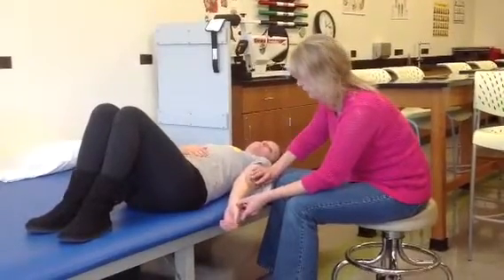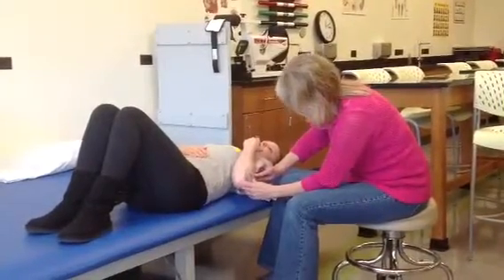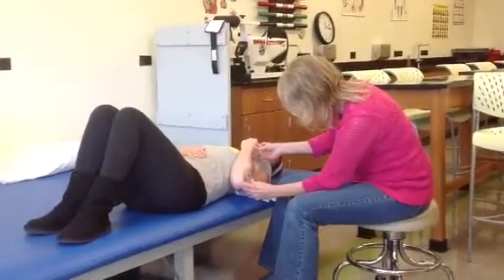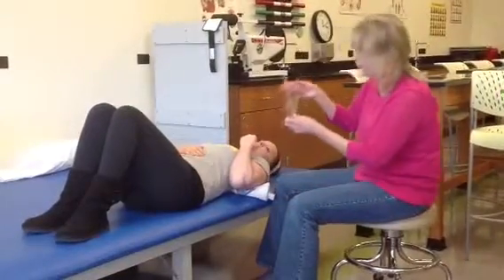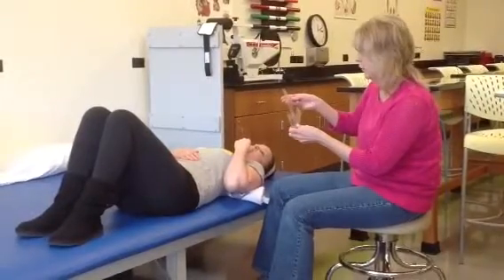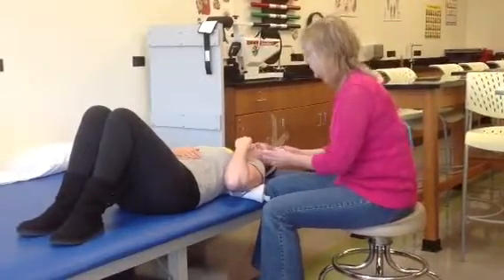Then we're going to ask the patient to raise her arm all the way up to get her flexion measurement. Again, we're going to have the axis right here, and then come right here to the styloid process of the radial bone here, and then we'll take it off and we'll look at it, and we have a measurement of about 150, which is right at the perfect range for flexion for the elbow joint.